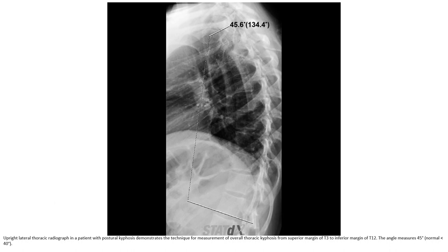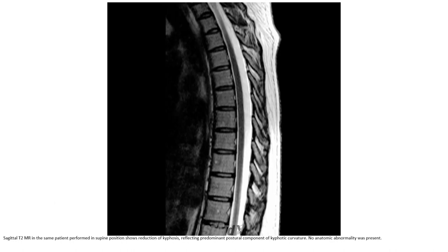The angle measurement is 45 degrees, which is greater than the normal threshold of 40 degrees. An image of the same patient performed in the supine position shows reduction of kyphosis, reflecting the predominant postural component of the kyphosis curvature. No anatomic abnormality was present.